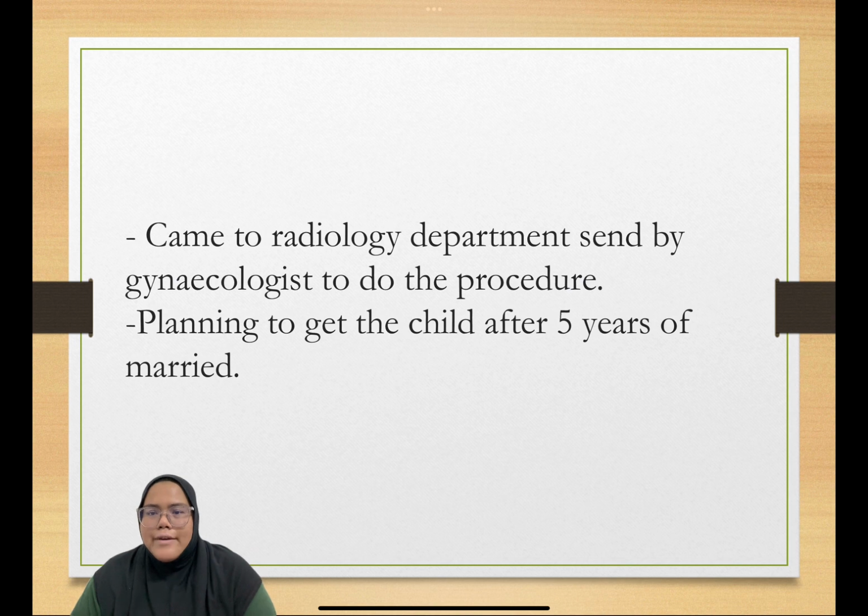This patient came to the radiology department in KPJ Putri with a referral letter from another clinic. She wants to do the hysterosalpingography, which is the HSG procedure. She has no history of miscarriages and is planning to have a child after 5 years of marriage.